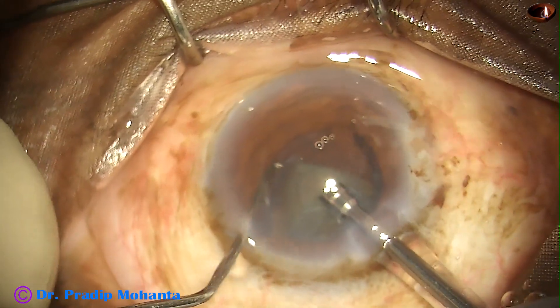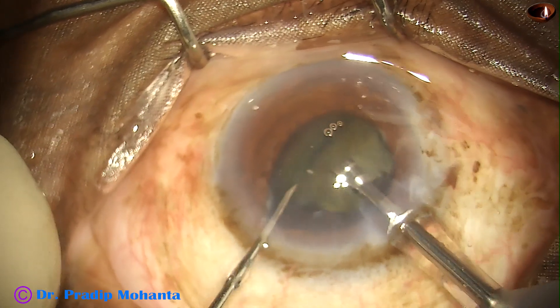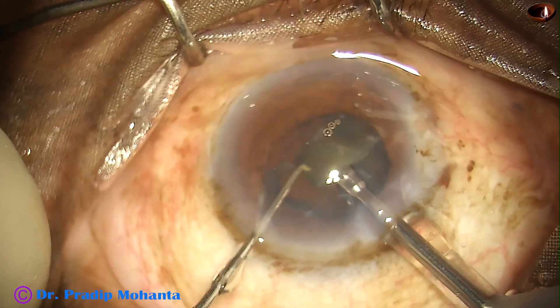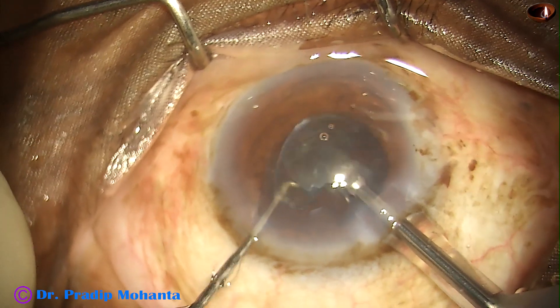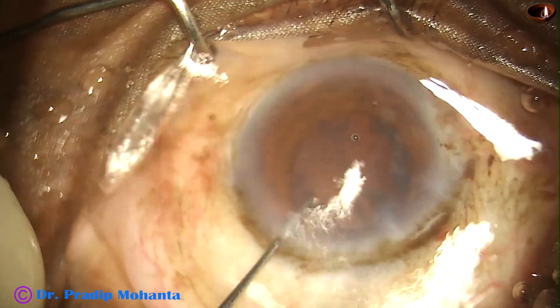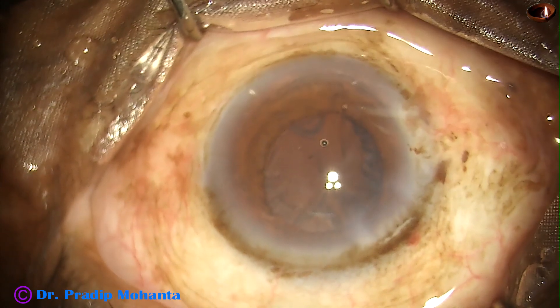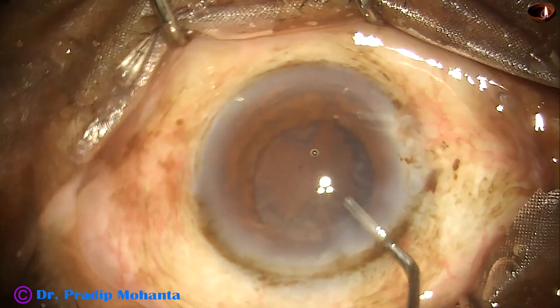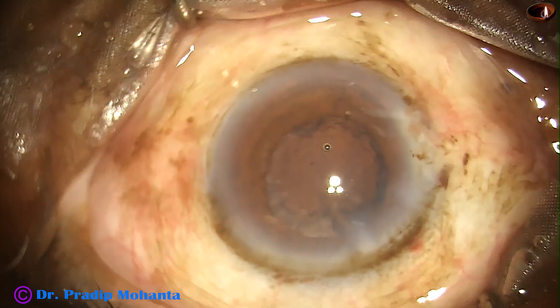The nucleus is almost managed. This is the last fragment. We can see some floppiness of the iris — the iris is tending to prolapse through the side port — but it's okay. The size of the pupil was maintained throughout the surgery, remaining almost 5 mm, and that was enough to complete the surgery with comfort.